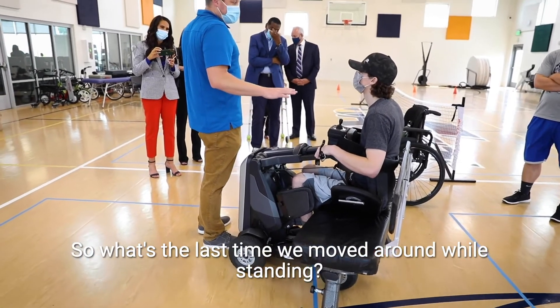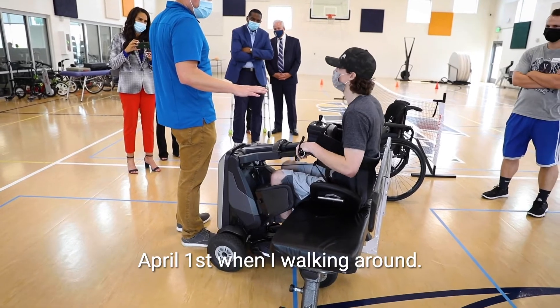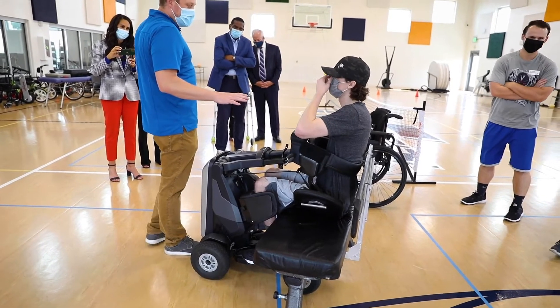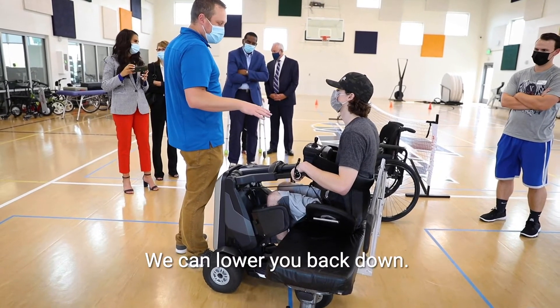When's the last time you moved around while standing? April 1st, when I was walking around. So if you feel lightheaded or anything, let us know and we can lower you back down.